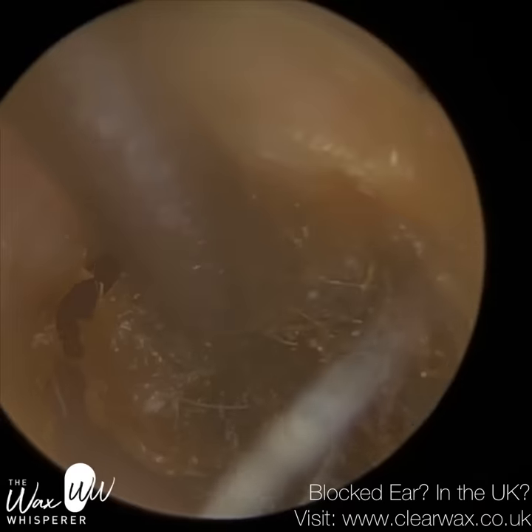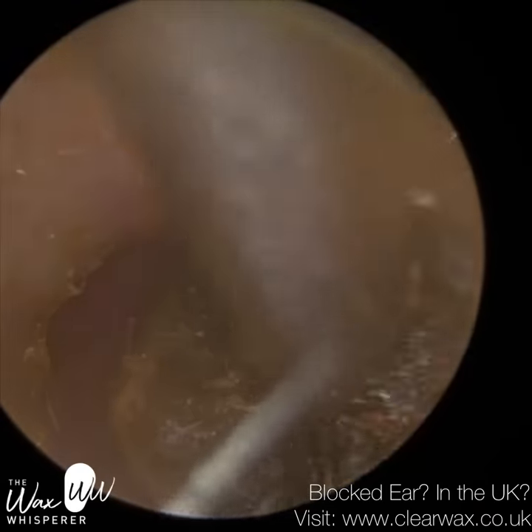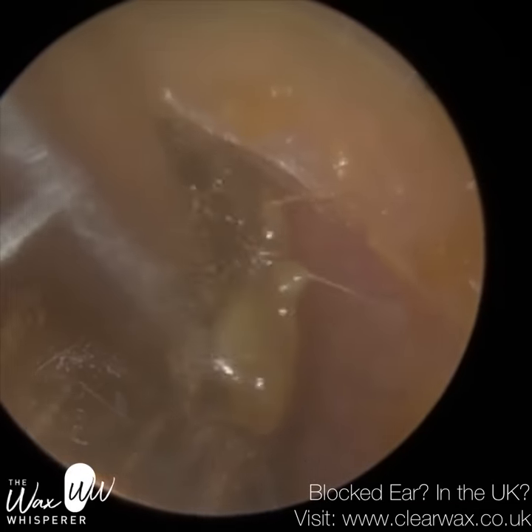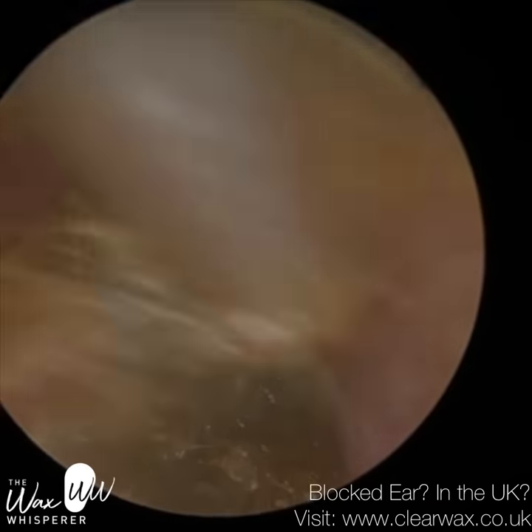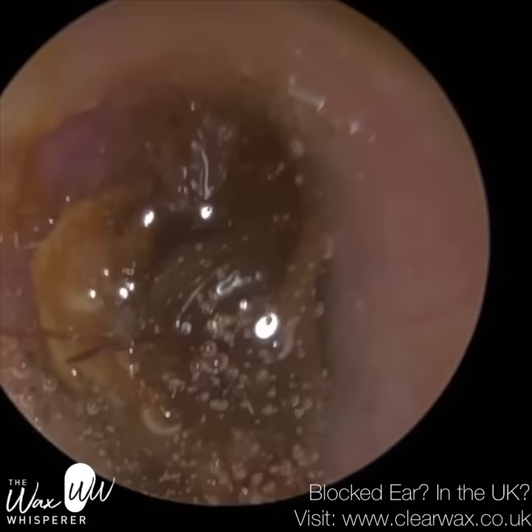So it's artificially bringing them together, but not that they're overlapping, which can then enable you to see wax very deep in the ear with both eyes independently. But if you've got a very, very narrow ear and wax very, very deep, you're still not going to be able to converge your interpupillary distance enough to take advantage of the binocular vision now.